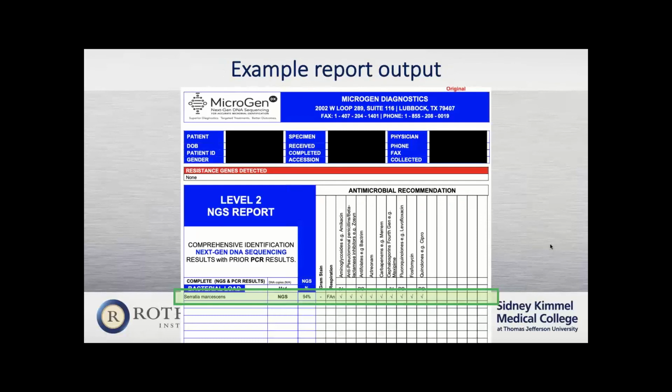And so once those sequence reads are generated, they're mapped against the curated library, as we mentioned, of those 50,000 microbes. The homology rate is around 99.7% per the lab team. And this is an example of a report that's generated. It gives the species, the relative abundance percentage of the entire 16S classifiable reads that are present.